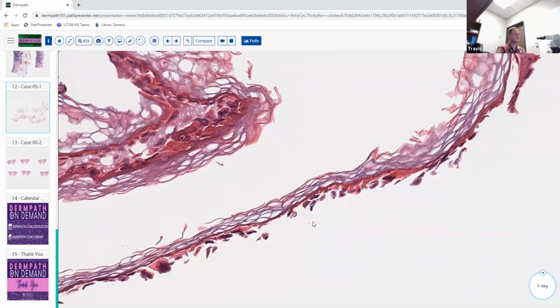Look like a bulla. Yeah, it'd be a blister. High blister, very high in the epidermis. This is just beneath the granular cell layer, possibly spinous cell layers. This is really high up there. So this isn't suprabasilar. So this would be a very flaccid blister.